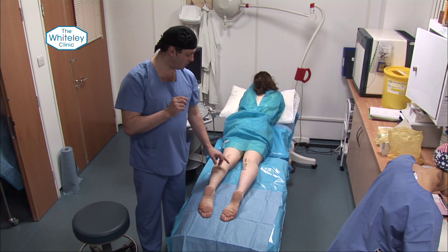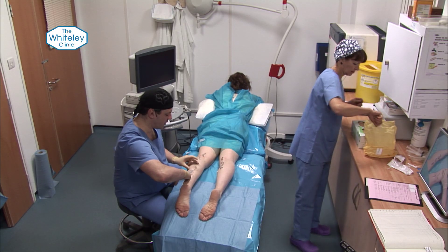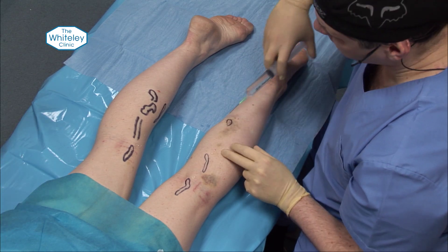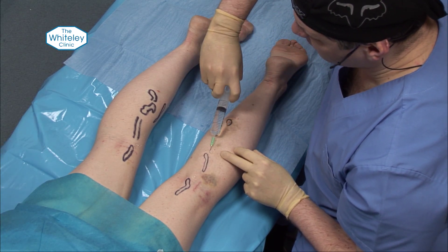We're now going to put a little bit of local anaesthetic just at the starting point of each area. We're going to inject the main anaesthetic. After this it should start getting a bit easier. We use this two-syringe technique, coming in through the little areas we've already started to numb and giving a little bit more, working our way up the veins that we're going to have to anaesthetise.